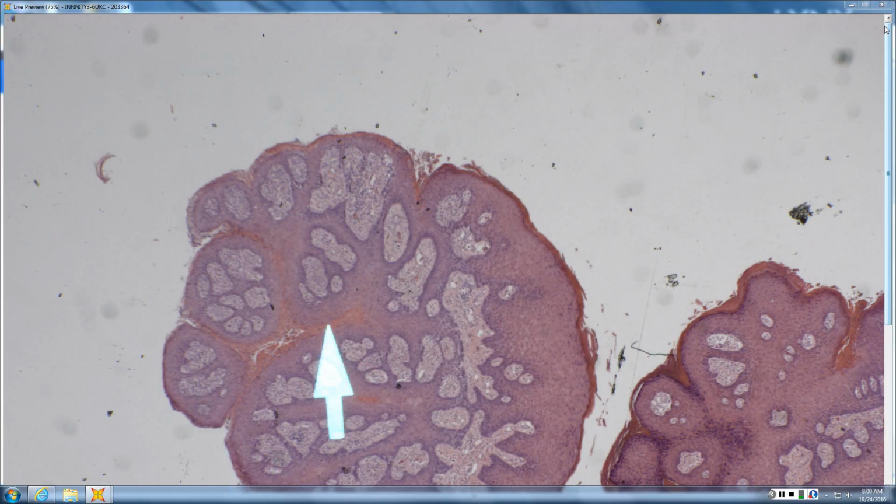And then you have the V's with neutrophils, and those V's are pointing down like arrows. Hey buddy, look down in the papillary dermis, pointing you to the xanthoma cells, and the xanthoma cells are usually subtle. So unless you catch it on architecture, you're not going to think to look.